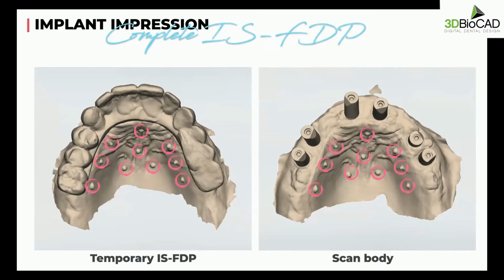So we need a common stitching point. Sometimes on the palate, we can use rugae as a stitching point to superimpose these two scans. But I like to apply flowable composite dots onto the palate and use that to superimpose these images together.